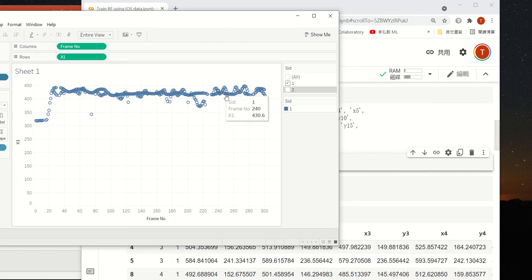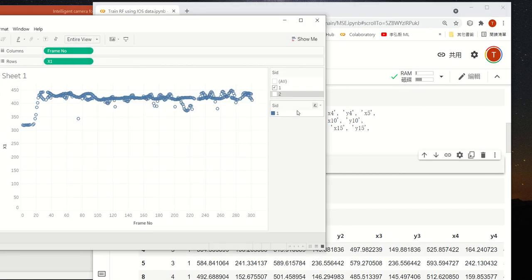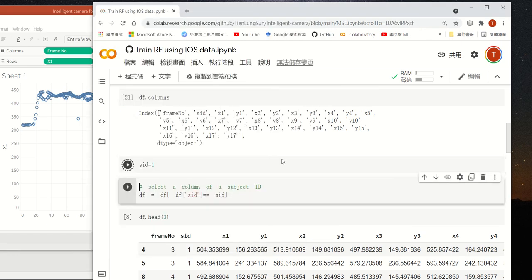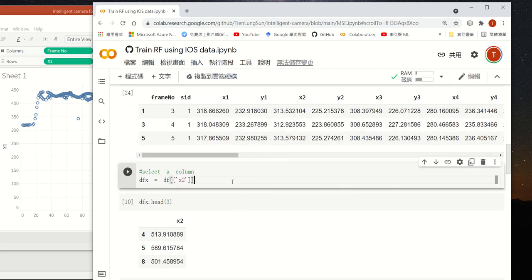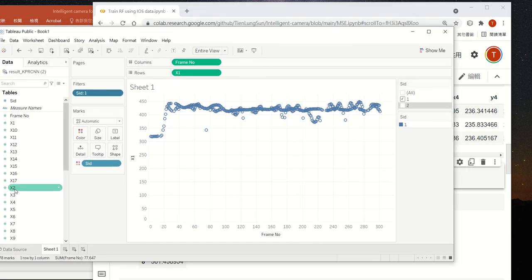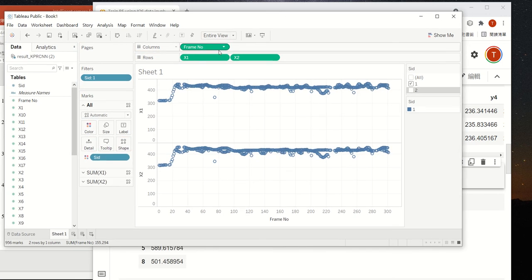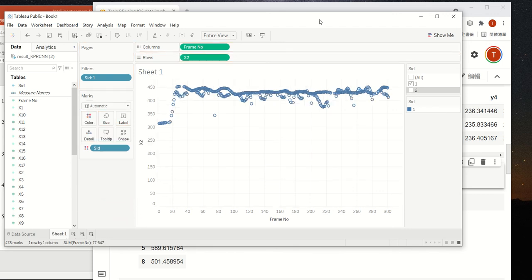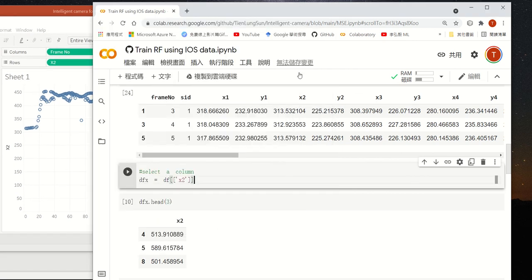For the time series, you calculate the multi-scale entropy of subject ID 1 and X1. So extract all the subject ID 1's data. Here I use X2, it's okay. Let's go to X2. We simply drag X2 here. It looks similar. If you don't want X1, just drag it to any empty place here. Now we calculate the multi-scale entropy of X2.